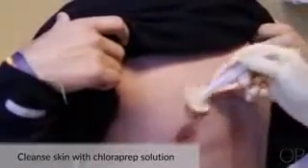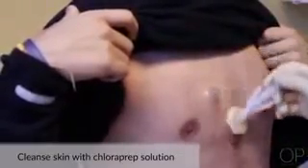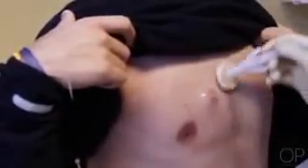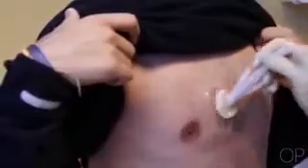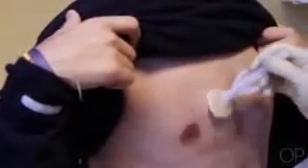Be sure to check your institution's policy in regards to which antiseptic agent should be used to cleanse the skin prior to accessing the port. Cleanse the skin with chloroprep cleaning solution per your institution policy, utilizing a 30-second scrub in a back and forth and up and down motion including the entire area where your dressing will adhere.